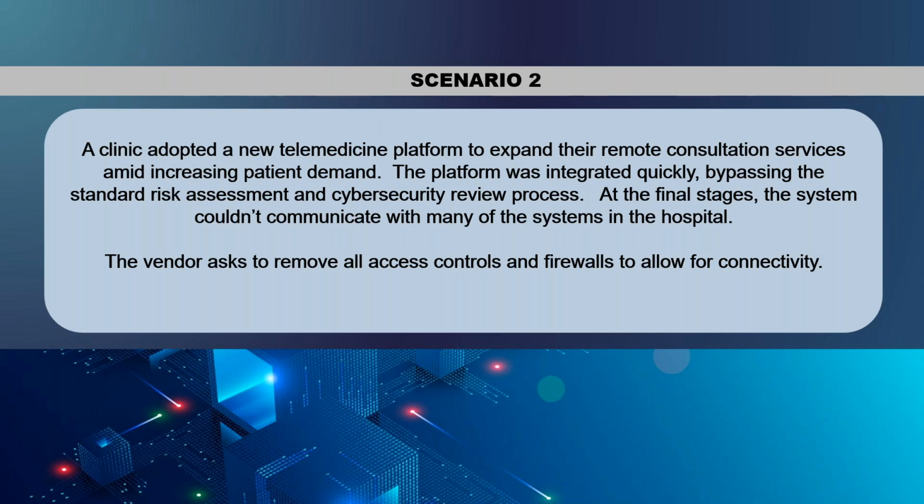Then when we actually started talking to the vendor, I asked, what ports are you actually needing? Because you don't need all 30,000 ports, because that introduces a huge risk of someone using whatever ports they want to inject information or malware. It's too many avenues to hinder the system. That also provided configuration challenges, because now that the system was already implemented, we had to go back and reconfigure everyone's system, retest it, and redo their reports. So it was double work on top of it.